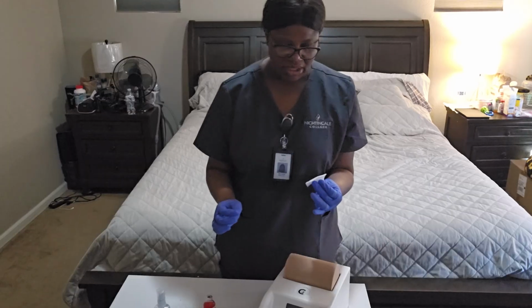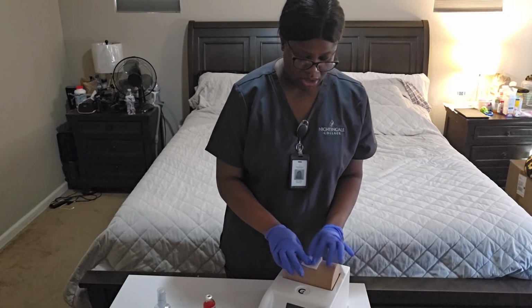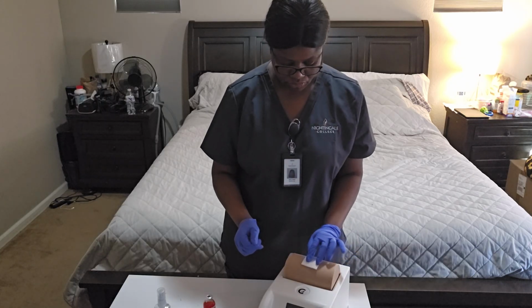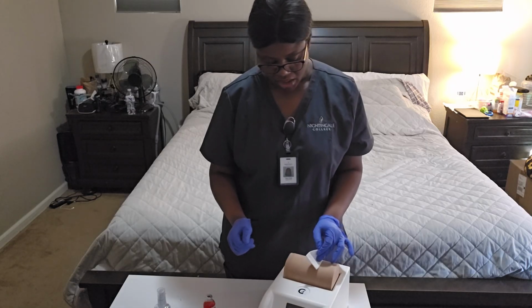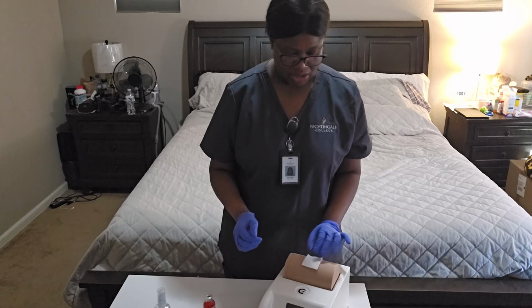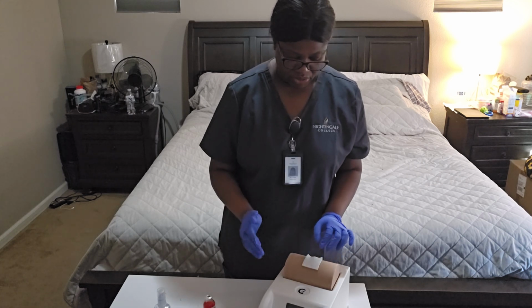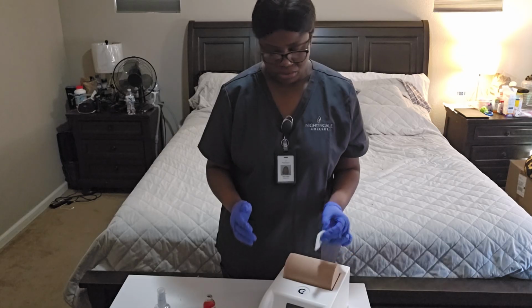I'm going to use the gauze and put it on top of my patient's site. I'm not going to massage it. I'm going to make sure that it's not bleeding, but even if it's bleeding, I'm going to apply a bandage. But it's not bleeding. I'm not going to massage the area, okay? Then make sure everything looks good.